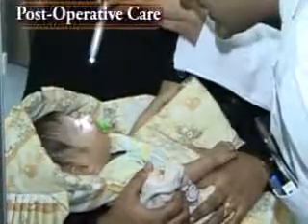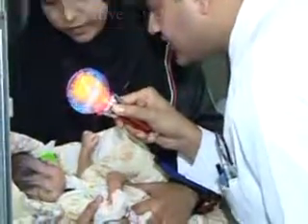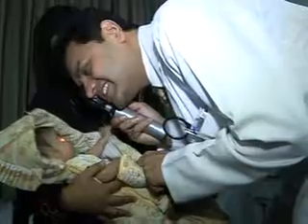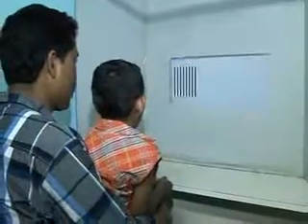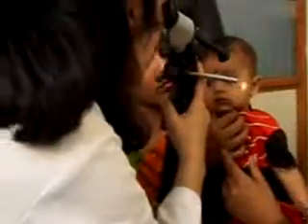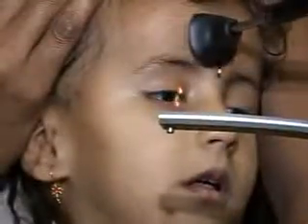On the day after surgery, perform visual assessment for fixation behavior, fundal glow on direct ophthalmoscope, and visual acuity on Teller acuity card in older infants. Also, perform an anterior segment examination with handheld slit lamp. 1 week after surgery, perform an evaluation under anesthesia. Perform refraction and then fit the contact lens or glasses as appropriate.